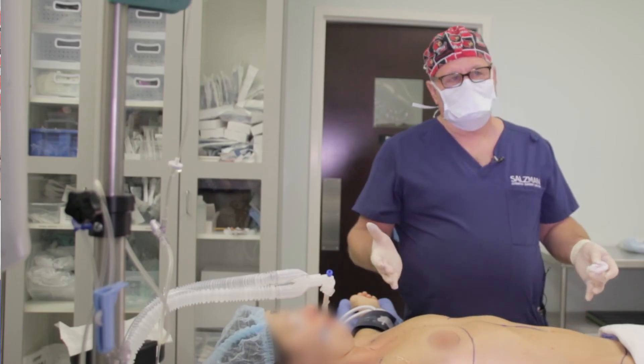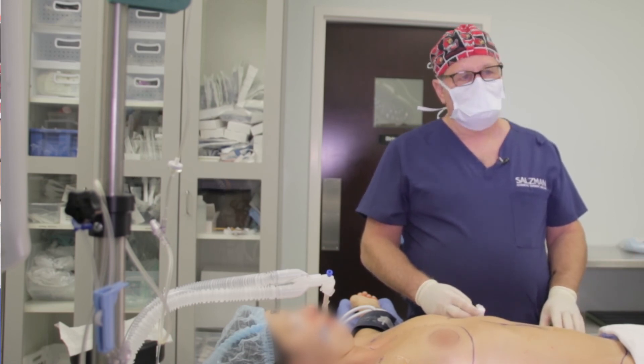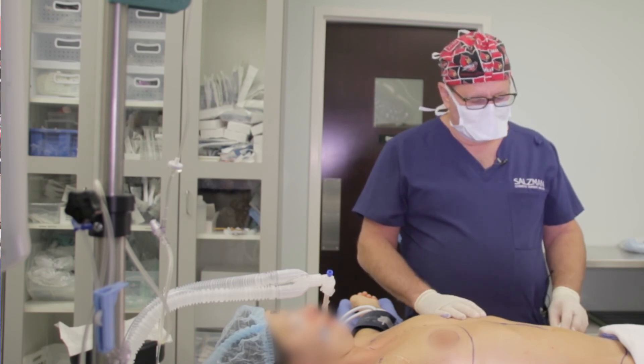As you can see, these blocks don't take very long. They're simple to do and the patients really do appreciate the time and effort that we place in doing that.